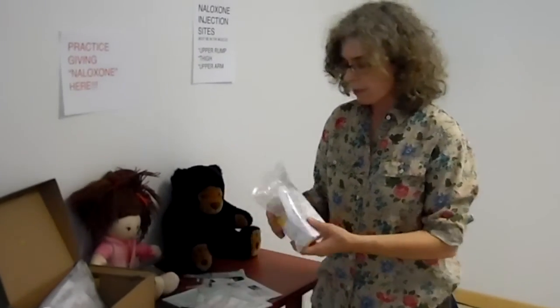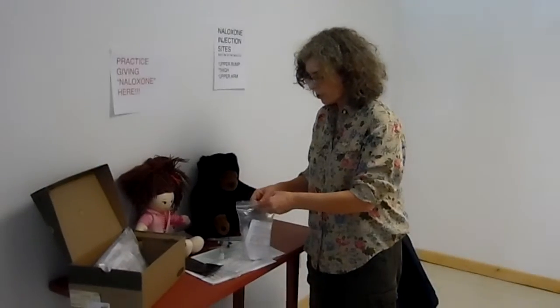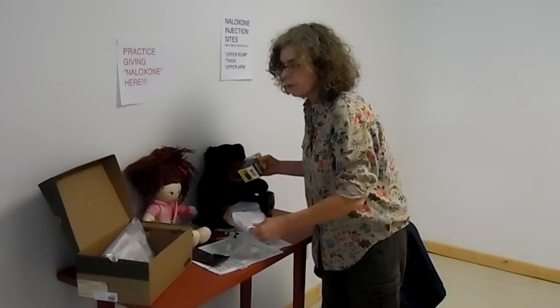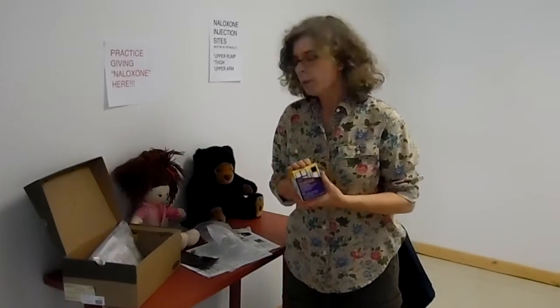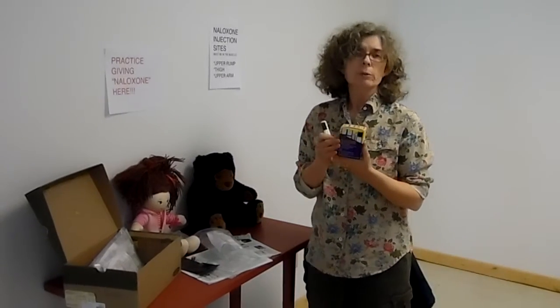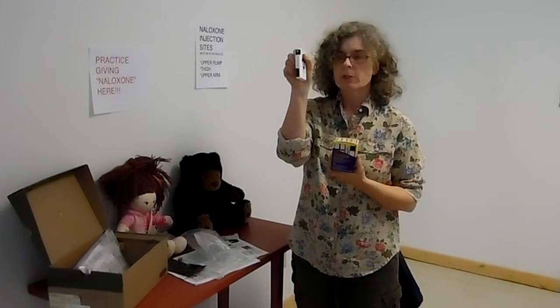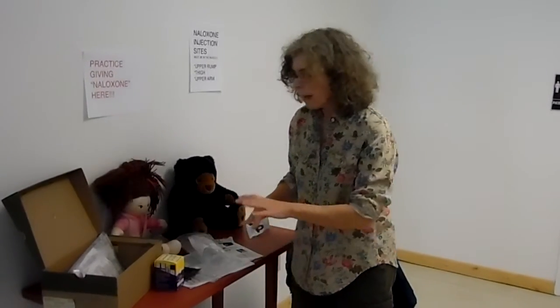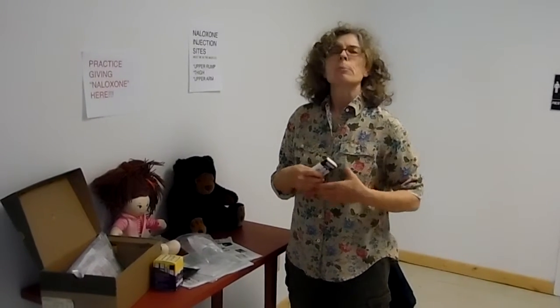Naloxone also comes in an auto-injector, which is really cool. This was approved for use in 2014. This kit contains two real doses similar to this cartridge — the real ones are purple and yellow. There's also a trainer in here. What's neat about these is they will talk you through the process. So if you're panicking, or if you are the person overdosing and you feel yourself going into overdose, you can hopefully inject yourself.